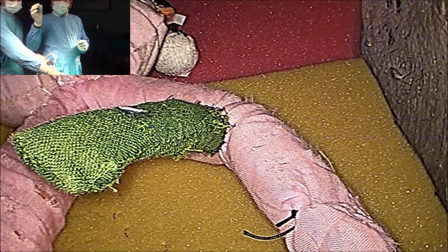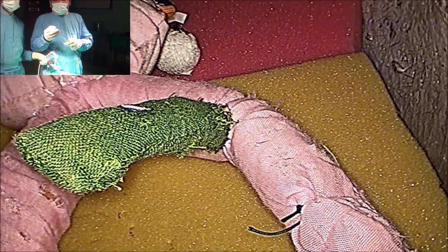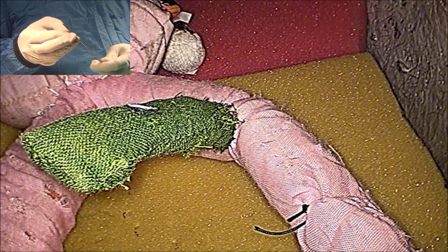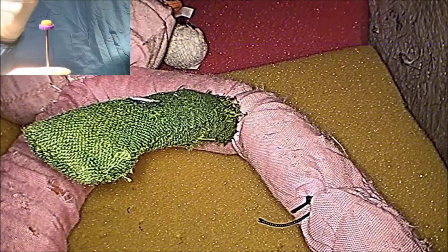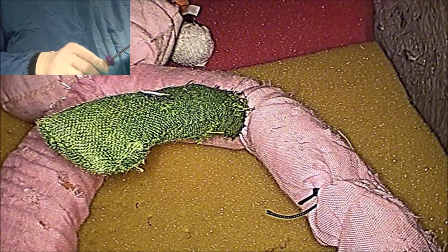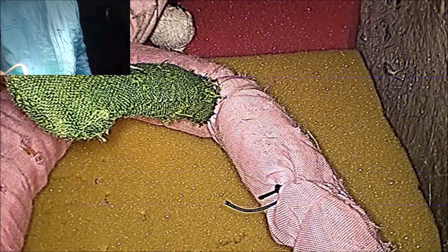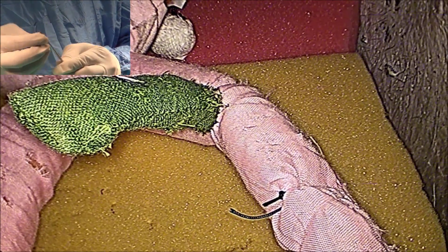You will take PDS or Monocryl — this is a knot pusher. First, put one end toward the tail end of the knot pusher and then feed the reducer. After feeding the reducer, go to the other end — the head end — and place this on the head end of the knot pusher. Now it is ready.